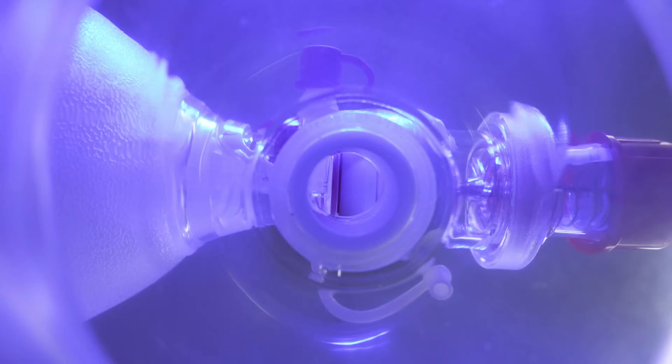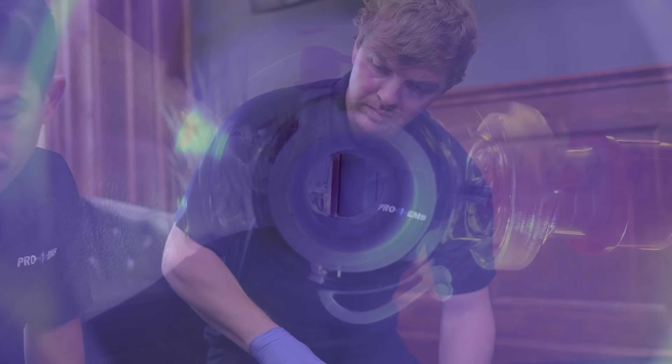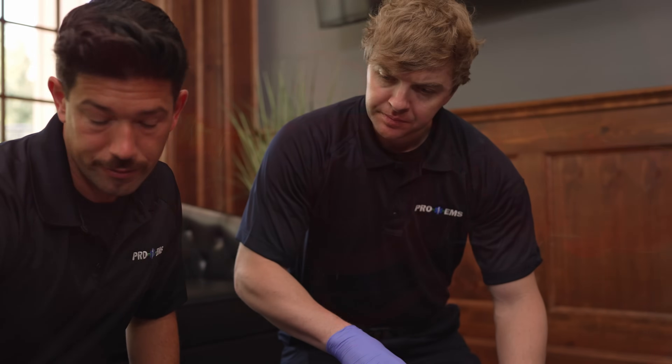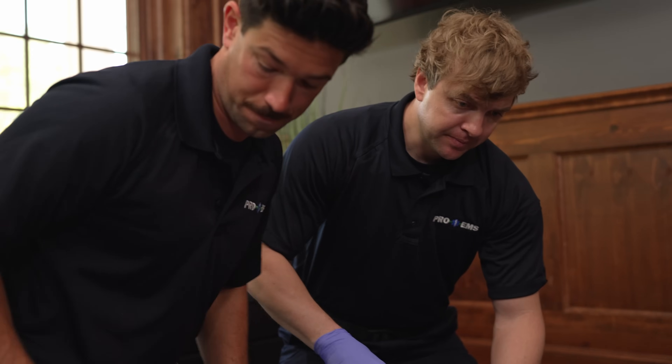He has a pulse, but he's not breathing spontaneously. He's in a junctional bradycardia rhythm. All right, let's get him on the pads.